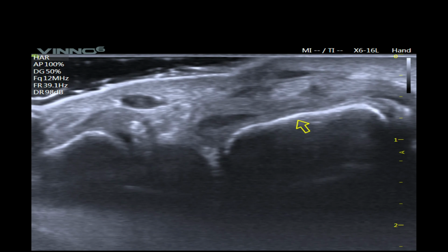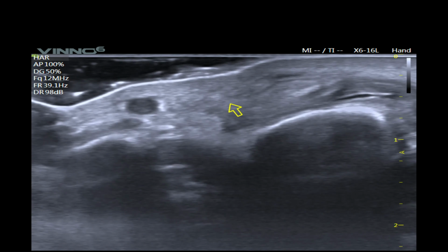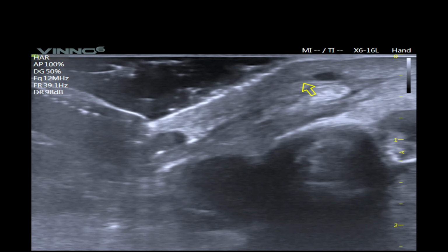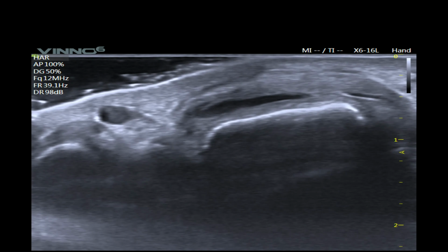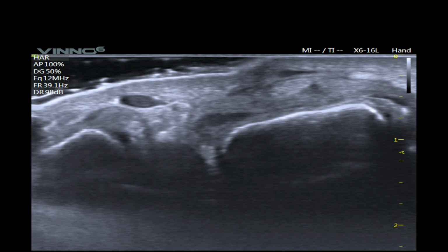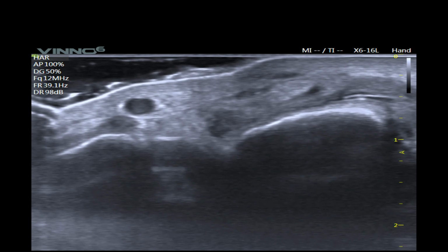Now this is a totally different type of injury. This is the index finger. This is the ulnar sagittal band. This is the radial sagittal band. This is the extensor tendon. So it's in the region of the dorsal hood of the ring finger. This climber was out running. He came around a bend really fast and his hand punched into the wall just on the inside with a lot of force.